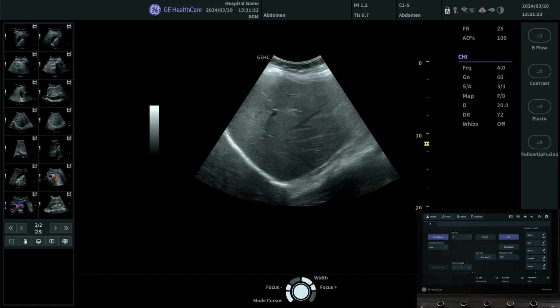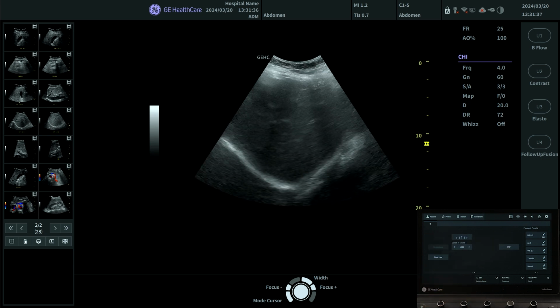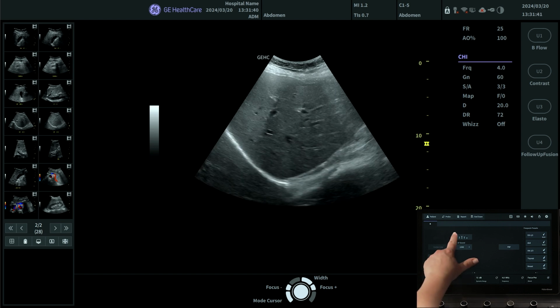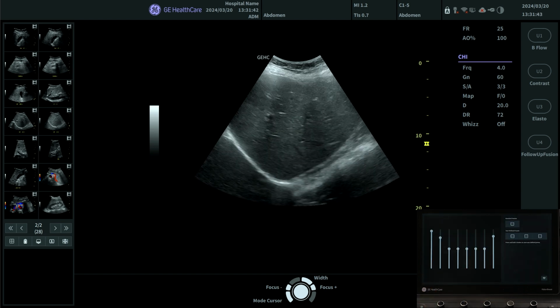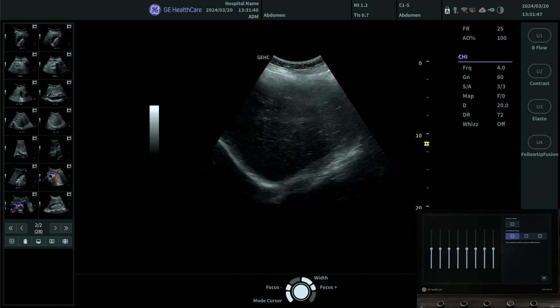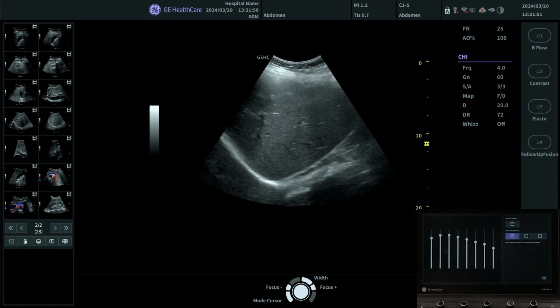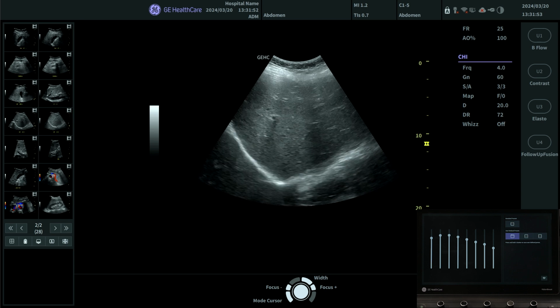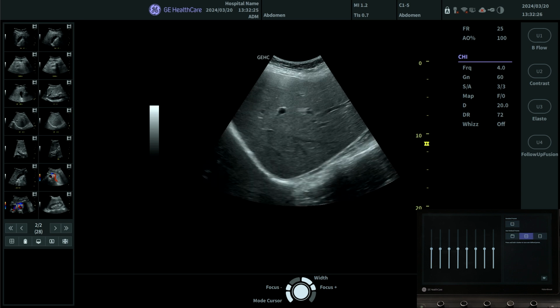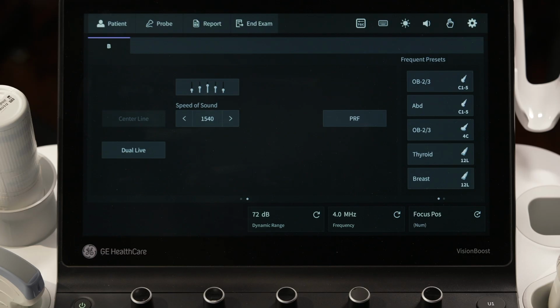Lateral gain compensation, LGC, is used to ensure the consistency of the gain levels along the lateral direction and is located on page 2 of the touch panel. The user-defined presets allow you to save customized presets by simply pressing and holding a tab under user-defined presets. The option will automatically turn off after the user discontinues use or exit manually using the LGC icon.